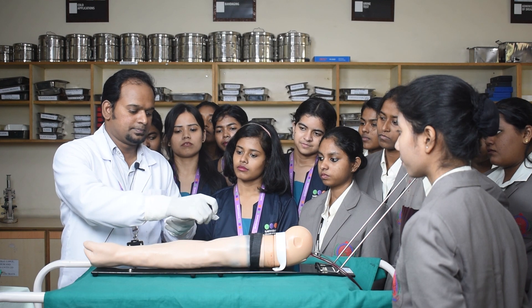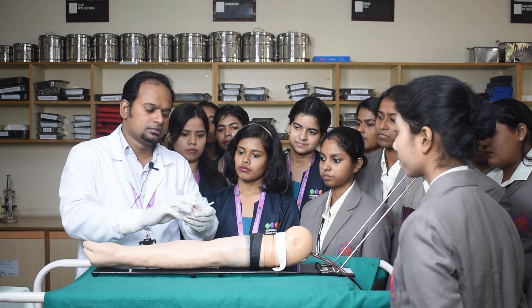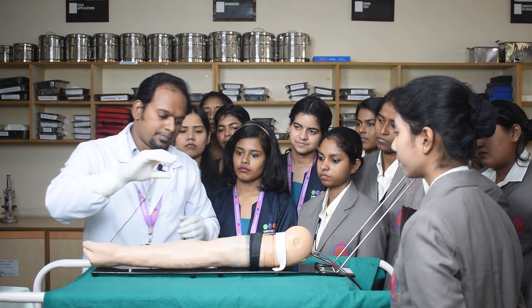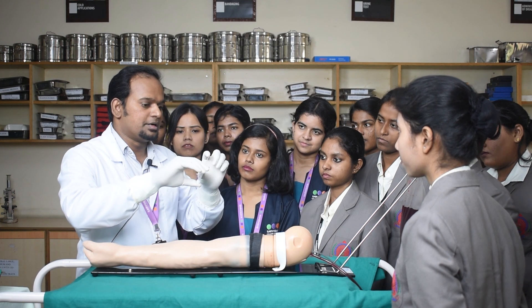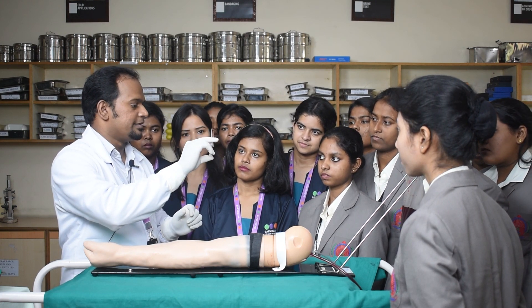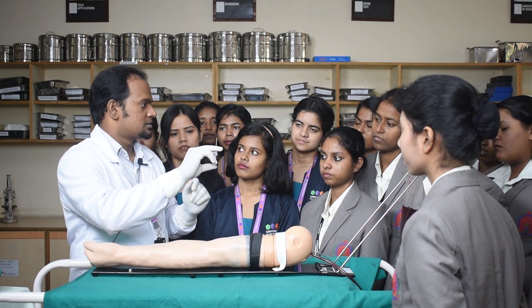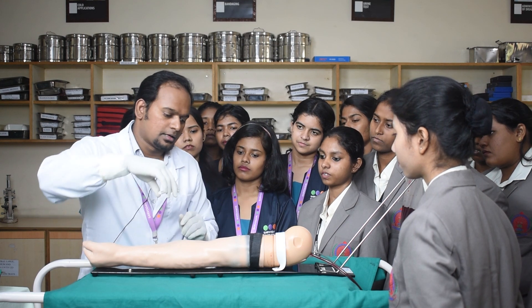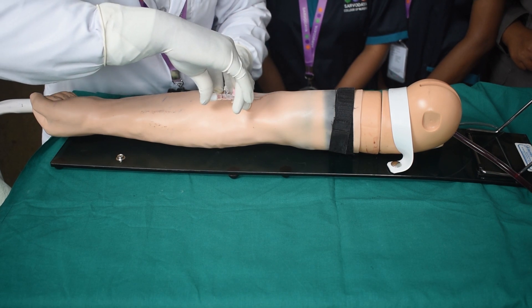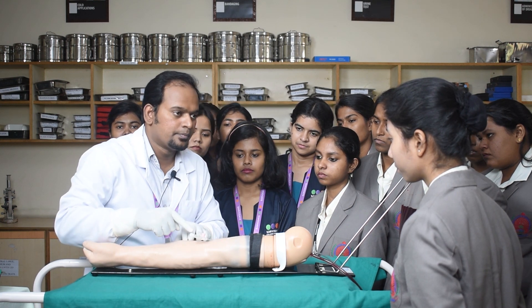Now it is time to take the preferred size IV cannula. I am opening the IV cannula — this is a 20 gauge IV cannula. Remove the cap and keep it away without touching the tip, as it is the sterile part. You can see how my index finger and middle finger support the top side while the thumb supports the other side of the cannula. At an angle of 30 degrees, you insert the IV cannula halfway and check for backflow of blood.